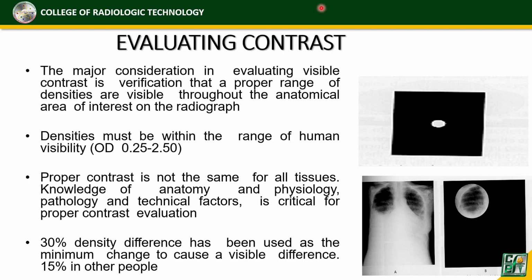So 30% density difference has been used as the minimum change. Okay, however, ang ginagamit natin ay the 15% rule. Okay, questions?